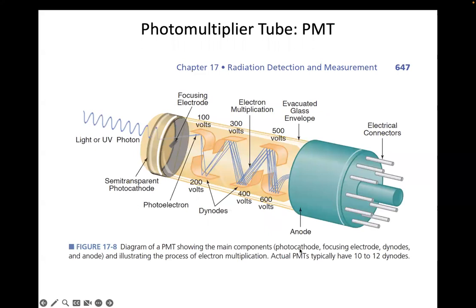This is a really interesting analog device, which changes basically a detection of a gamma ray by a flash in a material like a sodium iodide crystal or something like that. So you get a flash of light. What happens here is that light in this material makes an electron eject out of the material, and the electron hits this, it's called a dynode, which is a piece of metal, essentially, that's at a higher voltage than this. That electron hits the piece of metal and causes, say, 2 more electrons or 4 more electrons or whatever to come off of this material.